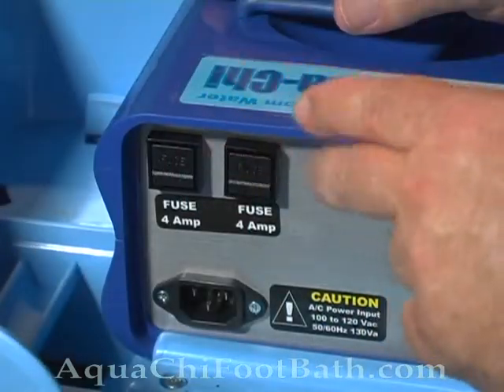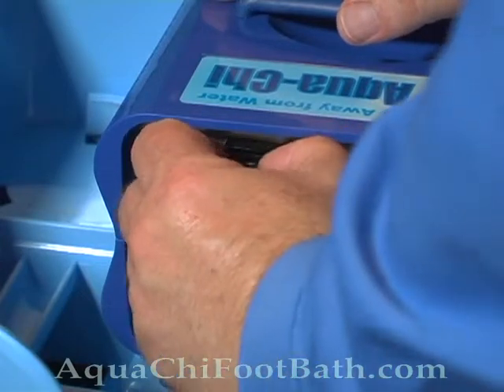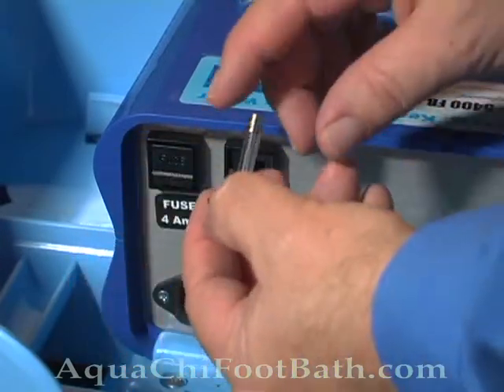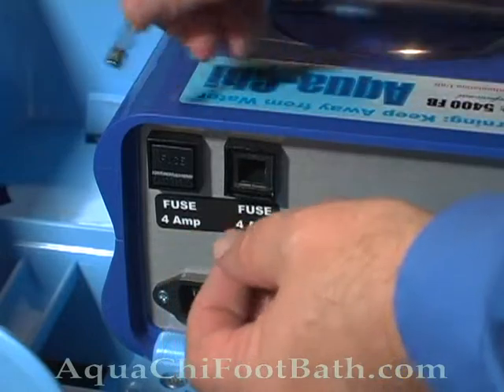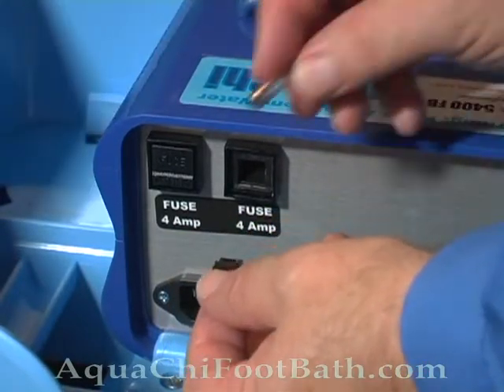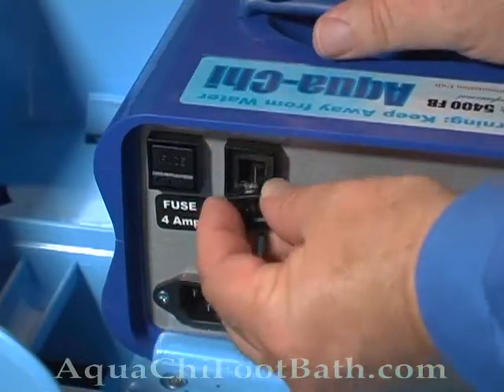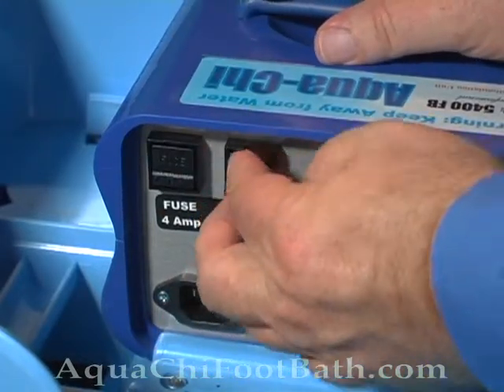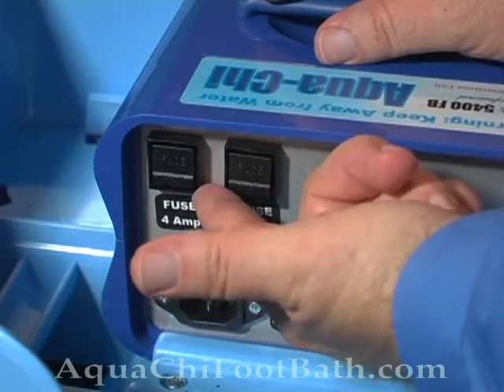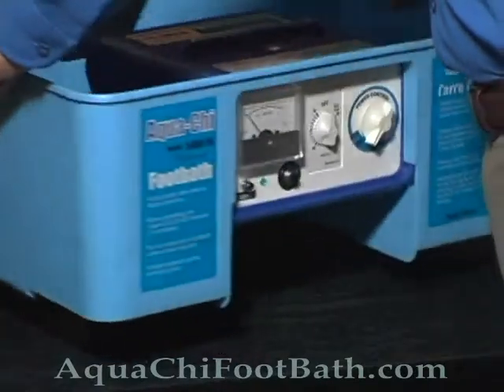To remove the fuses from the machine, push down on the base of the fuse holder, pull it out, remove and discard the old fuse. Now, replace it with the new fuse and reinsert it. Do the same thing to the other side. All right, now we've hooked the machine back up to power.